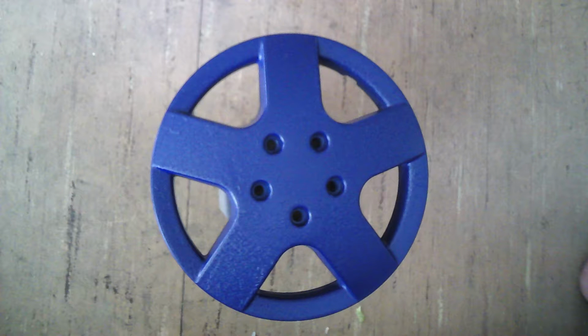Then I applied 3 light coats of clear coat paint to the hub. I waited about 15 minutes between coats. The reason I used 3 light coats was due to the shape of my hubcap. I didn't want to put the paint on too heavy and cause it to bubble. When I was applying the clear coat there was a bit of a rhythm to it: spray some clear coat and then rotate the hub and repeat several times. I had the hubcap sitting on a block of wood so I could rotate it without touching the hubcap.